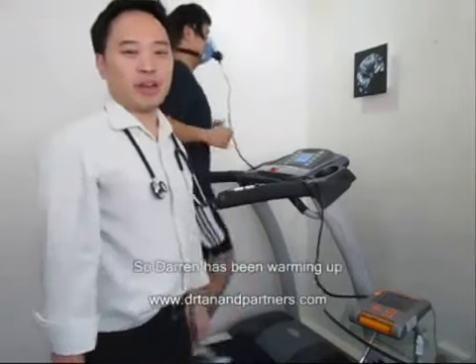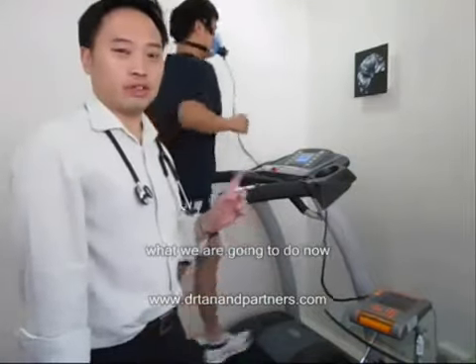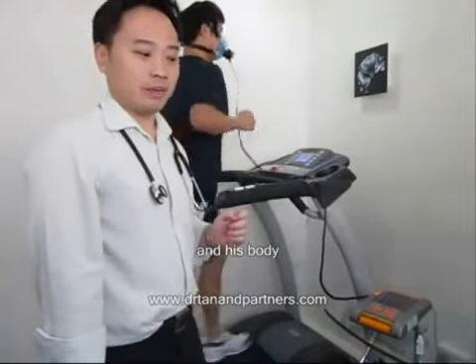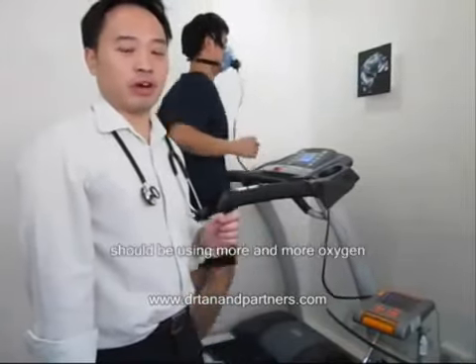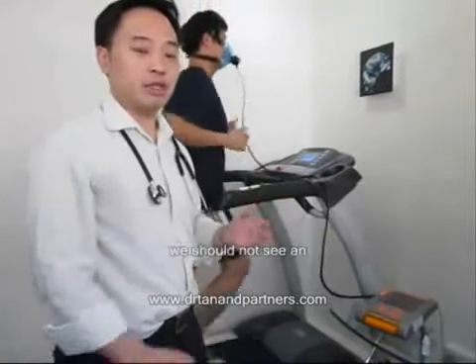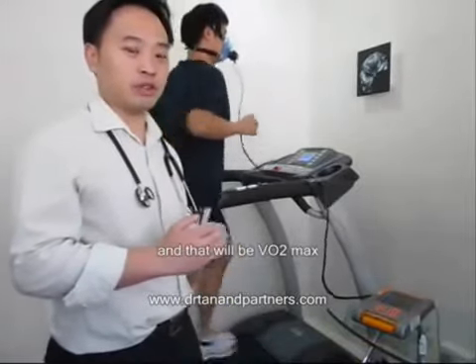Now Darren has been warming up for the past five to six minutes. What we are going to do to test his VO2 max is every minute we are going to increase the speed, and his body should be using more and more oxygen, until there comes a time that even though we increase the speed, we shouldn't see an increase in oxygen use — and that will be VO2 max.